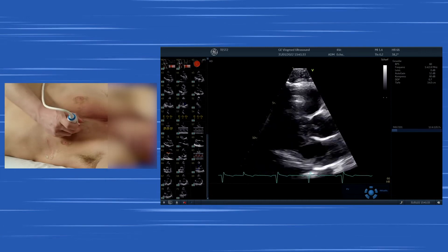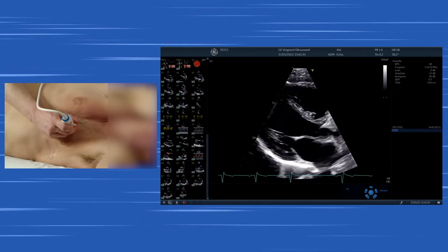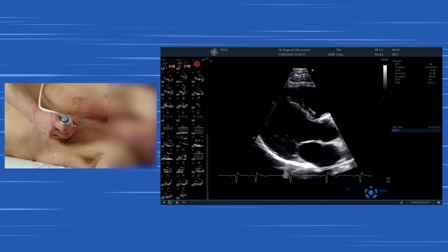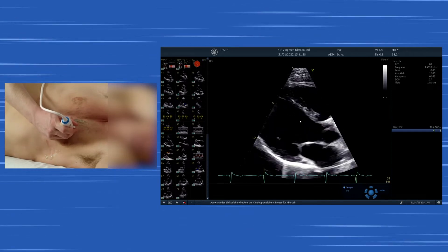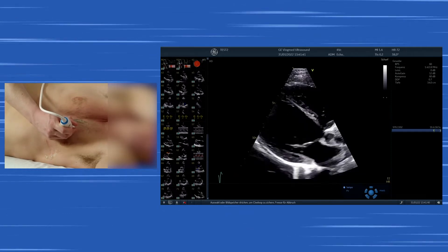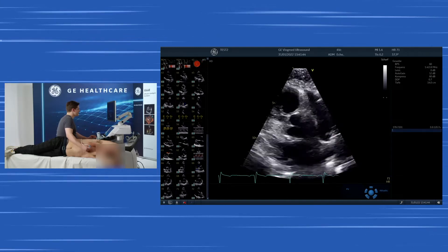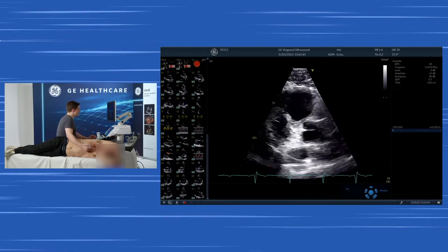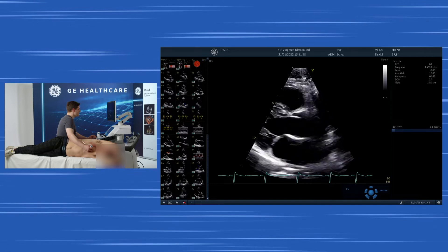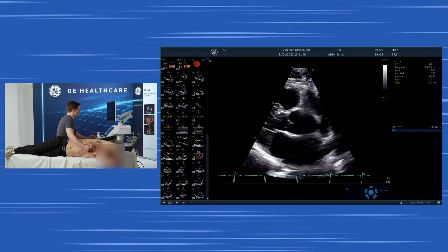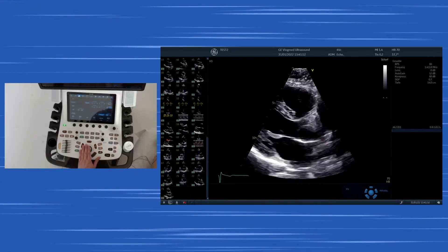We go again in the parasternal long axis view. We first oriented the marker towards the right shoulder and we have the heart in the center of the image. Now we adapt the parasternal long axis and move it a bit towards the left atrium and we save the image.